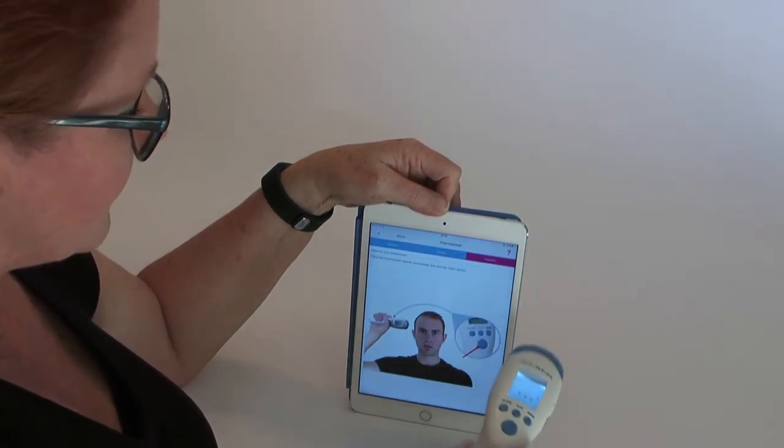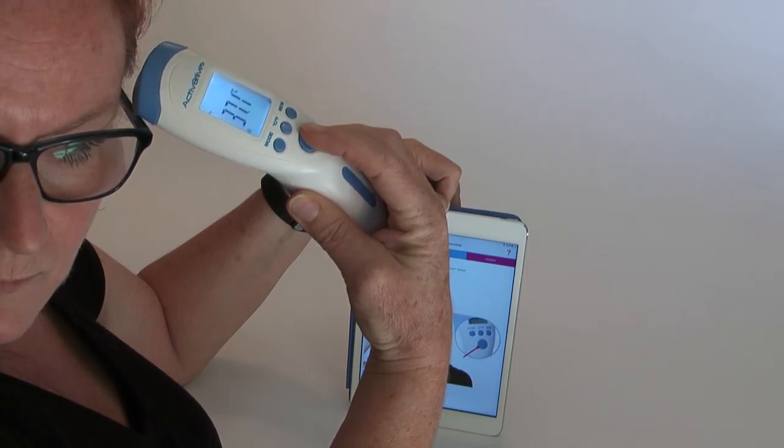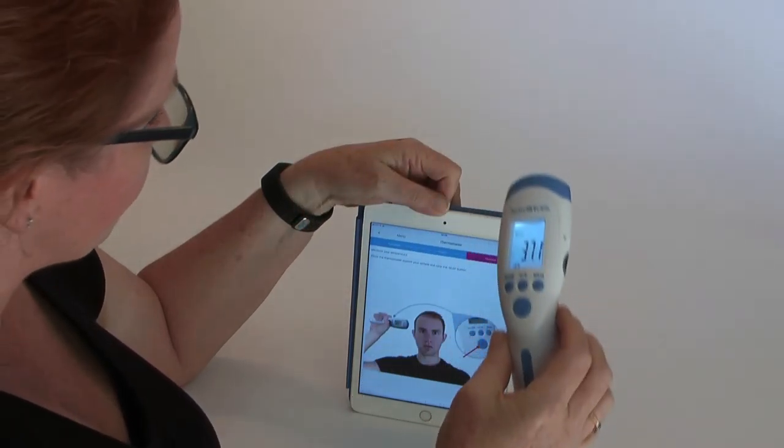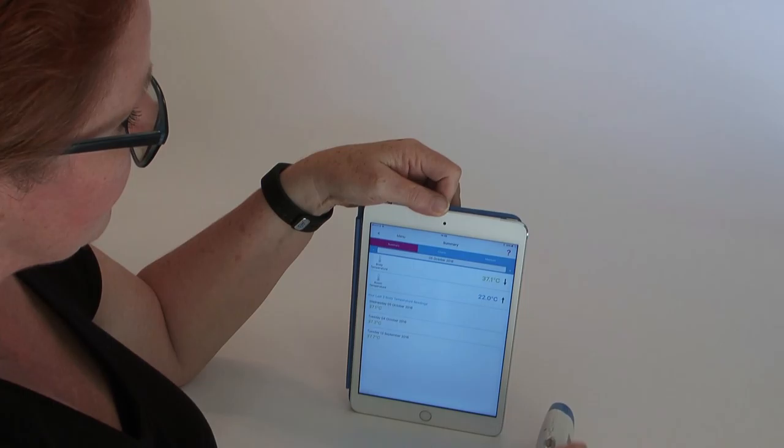Then to take a measurement, simply place it at the temple and press the large button, and this will take the temperature and will be revealed both on the device and the app.